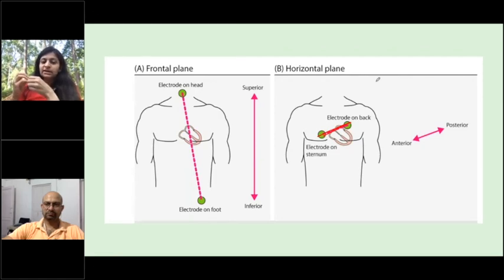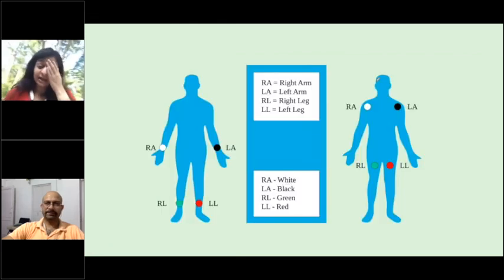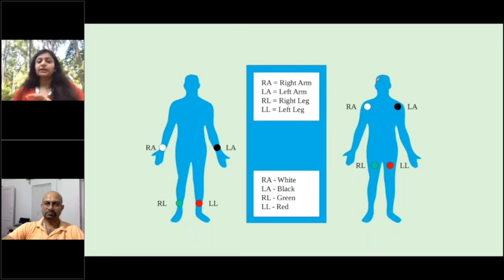And in the ECG, what you're looking for is actually a predominant vector because every area of the heart is capable of giving you a beat, right? But they are very tiny areas and tiny things. All of these then sum up to form a predominant direction of electricity flow, which you can then see based on the frontal plane or the horizontal plane. Now, that is again very important. So if you don't understand, please stop us because otherwise, there's no point of this lecture.